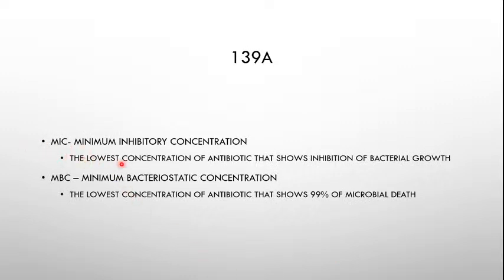So minimum inhibitory concentration is the lowest concentration of antibiotic that inhibits bacterial growth. Okay? The other one is the antibiotic concentration that shows 99% microbial death. So death lang yung pinagkaiba. Inhibition of bacterial growth. Kaya nga inhibitory eh. Pero sir, di ba sabi mo kanina, bacteriostatic is different from bactericidal? Pero nga, 99% of microbial death ang pinag-uusapan natin. Okay? Huwag masyadong pilosopo.